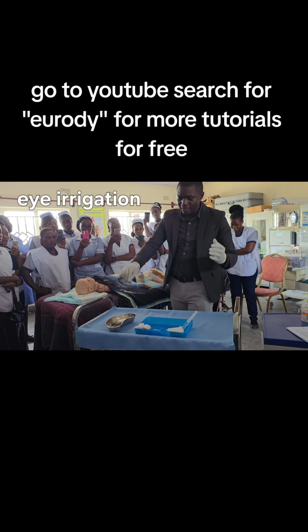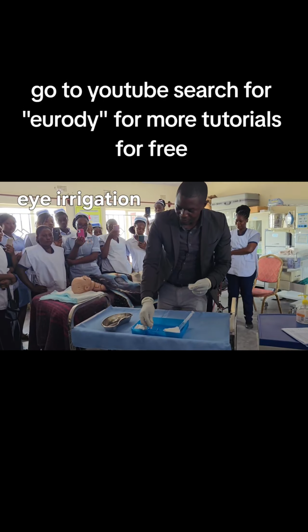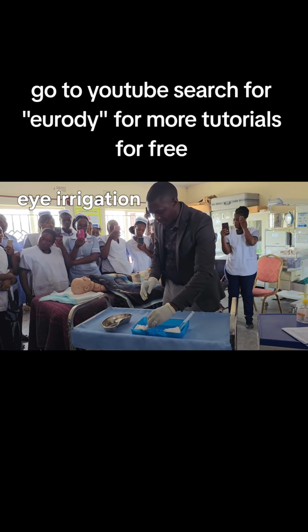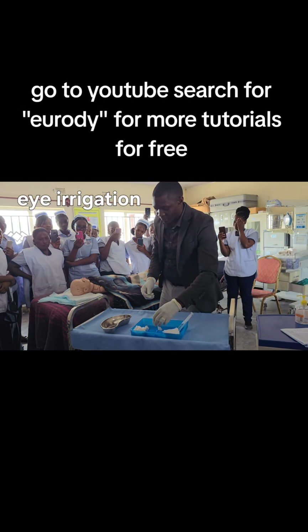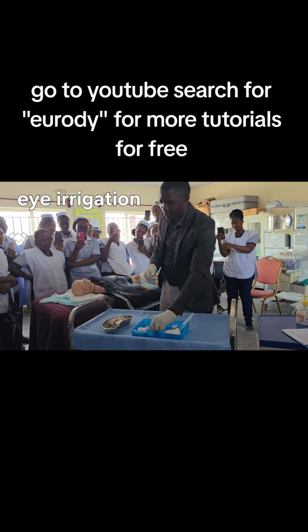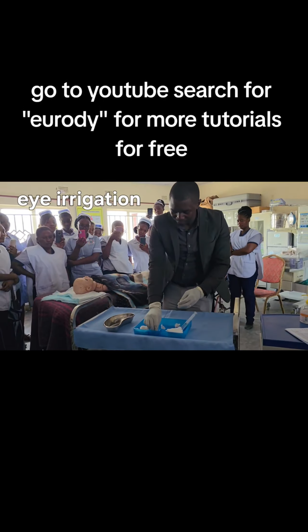After you don in gloves, for eye irrigation, which is followed by swabbing, you prepare at least 4 wet swabs, 2 for each eye. And this is just in OSCE. In real life, you may find that the pus coming out of the eyes is a lot, so you may still need to prepare a lot of swabs.